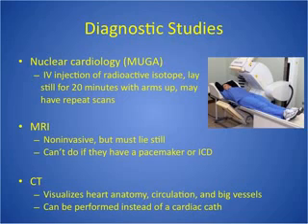Another thing that we know about CT with cardiac is the calcium score screening heart scan. And we're seeing a lot of these on mobile sites now. What this does is it detects early calcifications, so it's a predictor of whether you might have a cardiac event. Again, remember, no sedation, no NPO, typically not an IV, although they might do contrast. Very quick, low risk, get results fast.